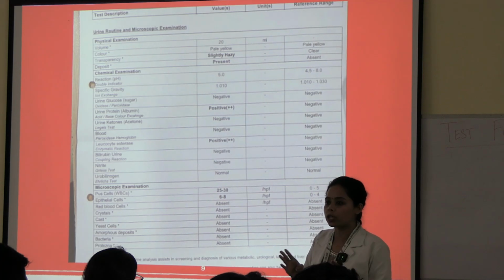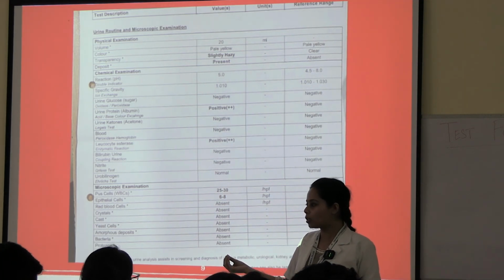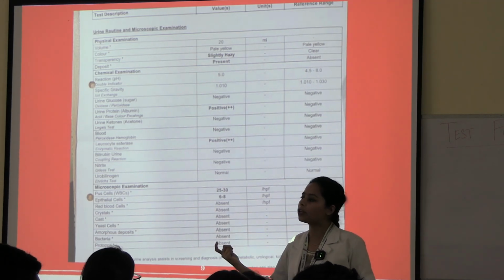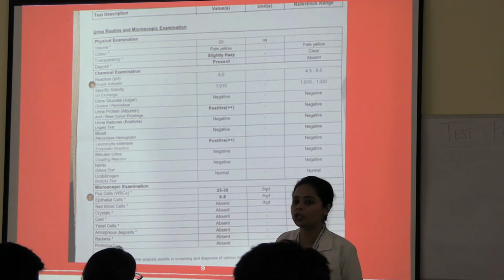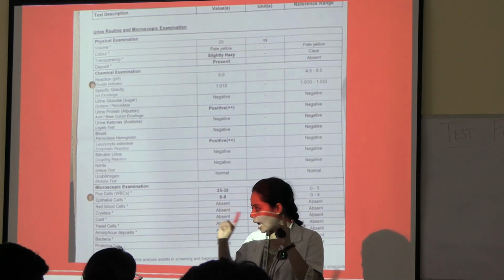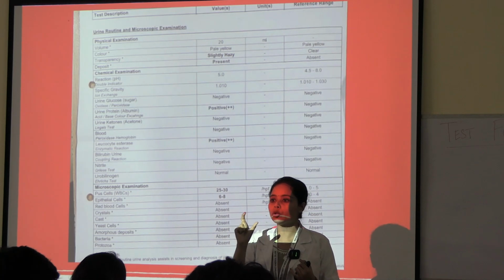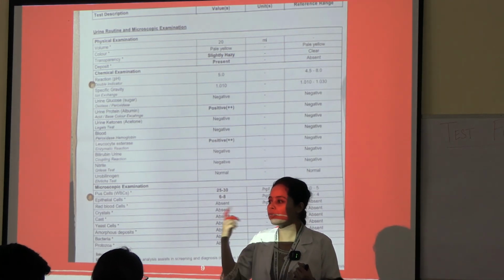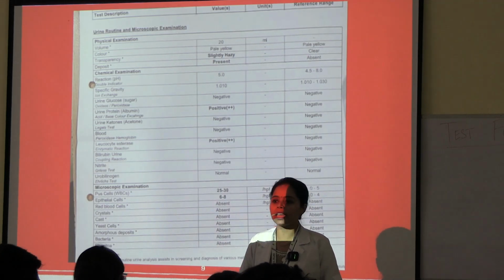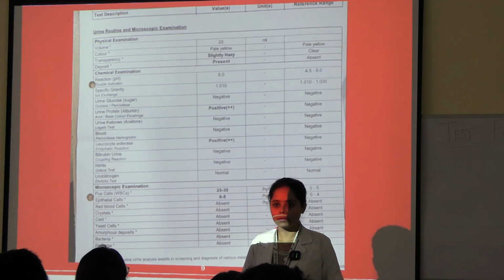So seeing the microscopy report you can say that she's having some infection. Now, what causes infection? Only an organism will cause infection. This lady said she's having a urinary tract infection, yes, but we cannot just say that seeing the microscopic report. You will have an idea that she's having an infection, but for the specification of the organism you advise a urine culture. That's where you'll understand. So the patient has to do a urine culture. This is urine routine and microscopic examination, got it.